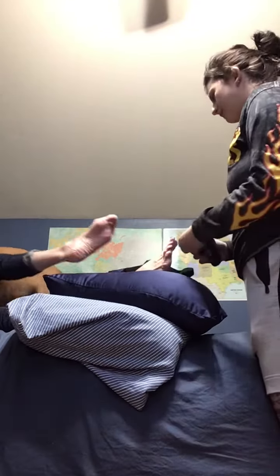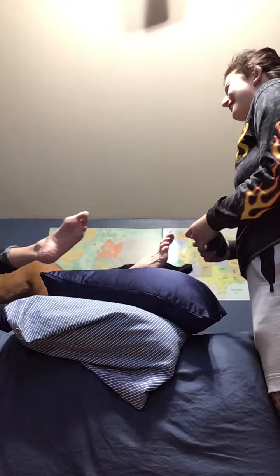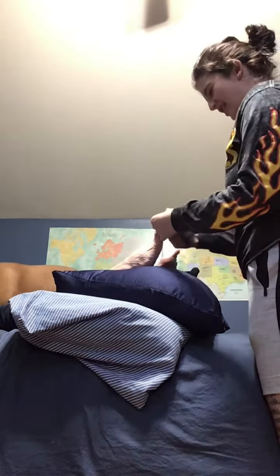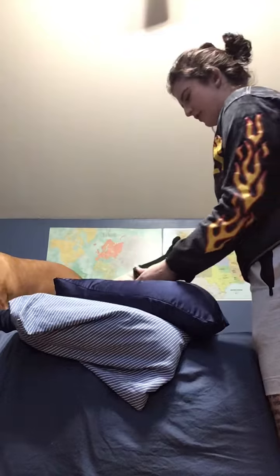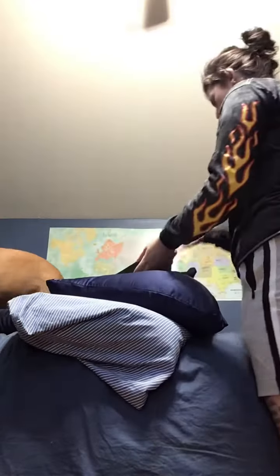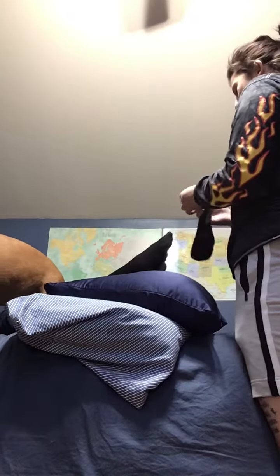I'm gonna roll them up like I would a long sock, making sure the bottom of the sock reaches her heel, making sure the sock is for her and it's all rolled out for her to have a clean slate. Then I'm gonna do the other foot.